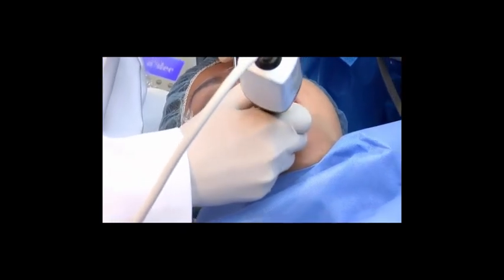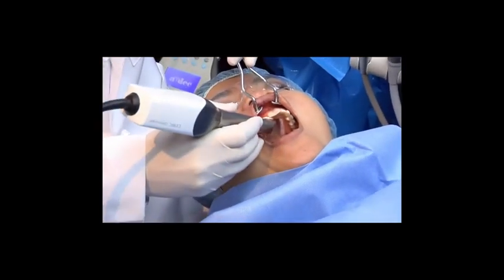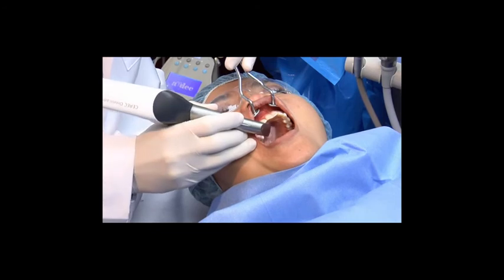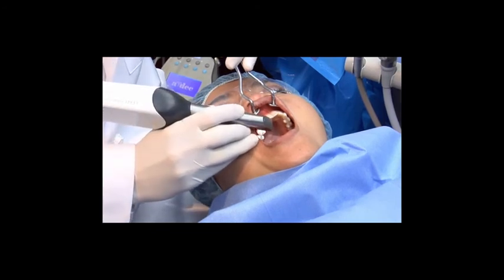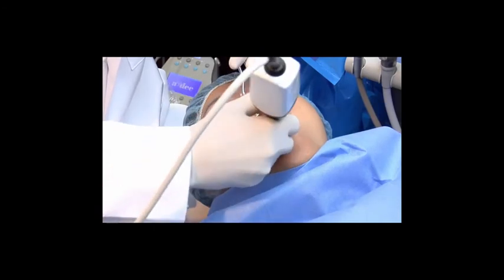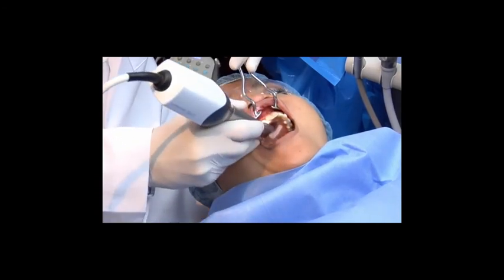Once that is done, now we can go ahead and do our additional CEREC scans. This, for example, we can scan our gingival mask. At this point, once we have done this and completed the surgery, here we can do the gingival mask scan with the CEREC, and this is all done for the fabrication of the immediate provisional.